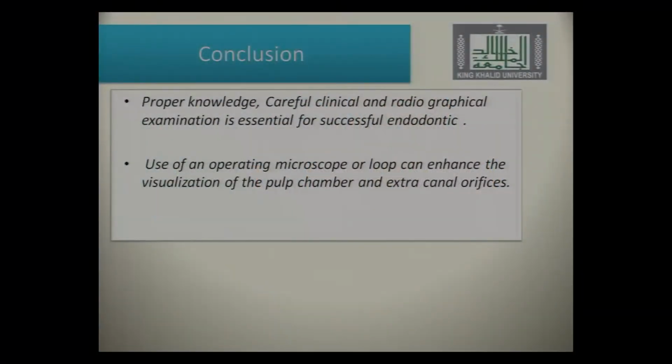Conclusion: proper knowledge, careful clinical examination, and digital radiography with three-dimensional imaging are essential for treatment of these endodontic teeth. Use of an operating microscope or loupes can enhance visualization of the pulp chamber and extra canal orifices. Thank you, Dr. Majid.